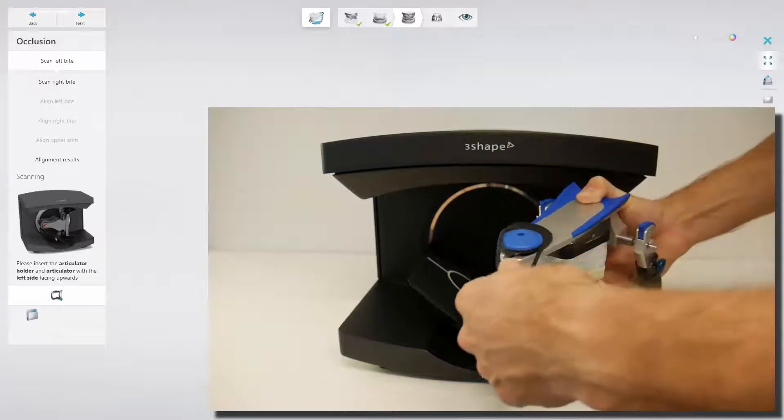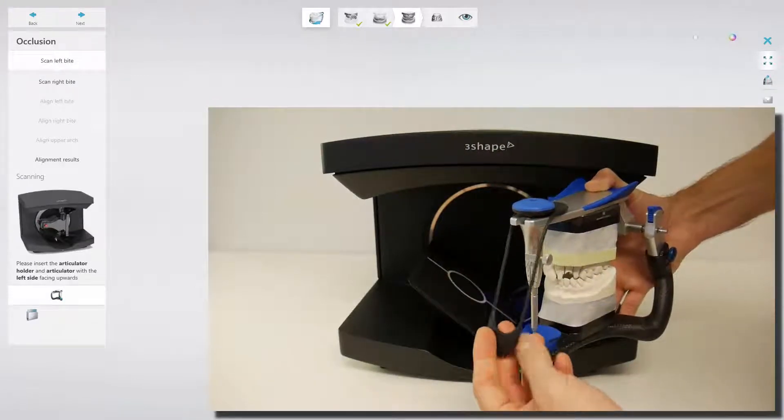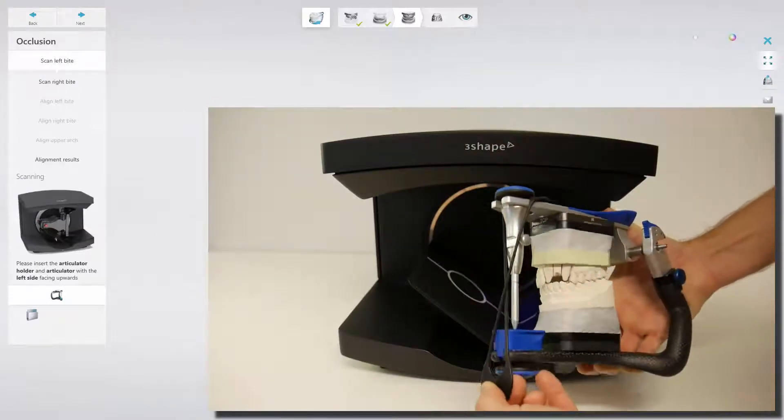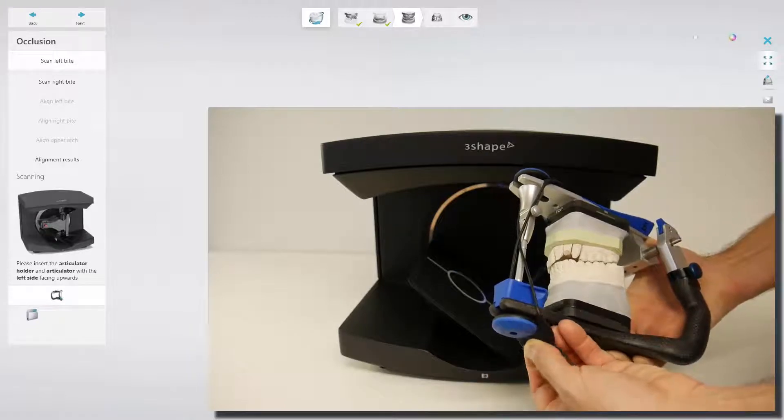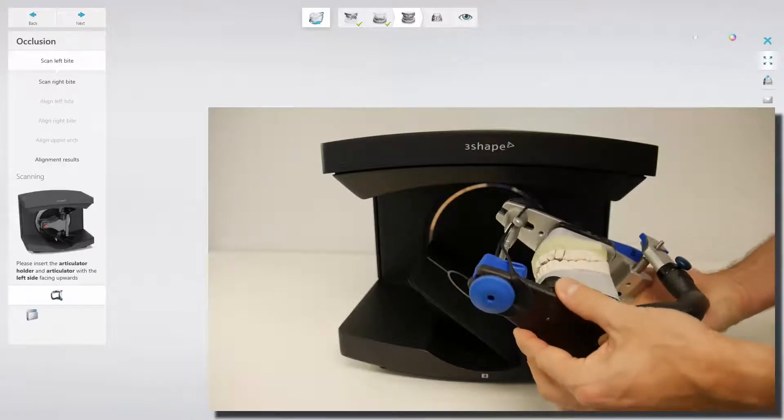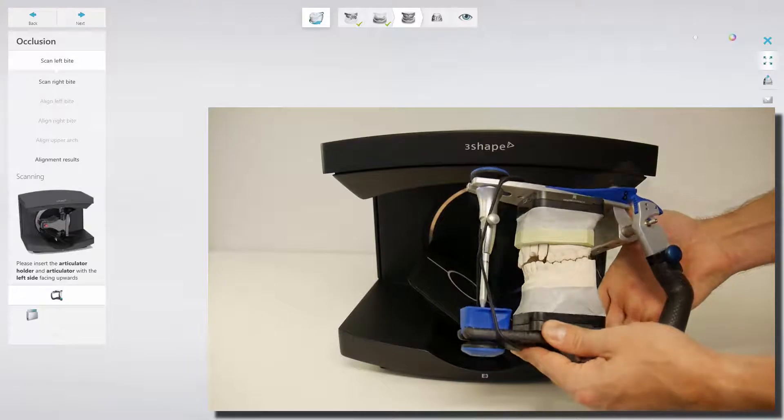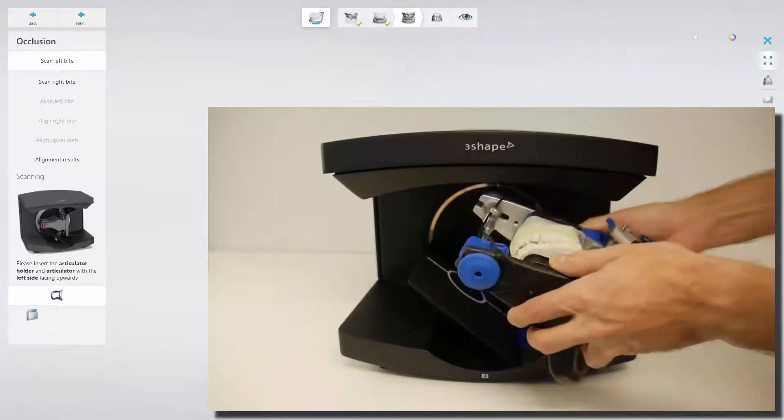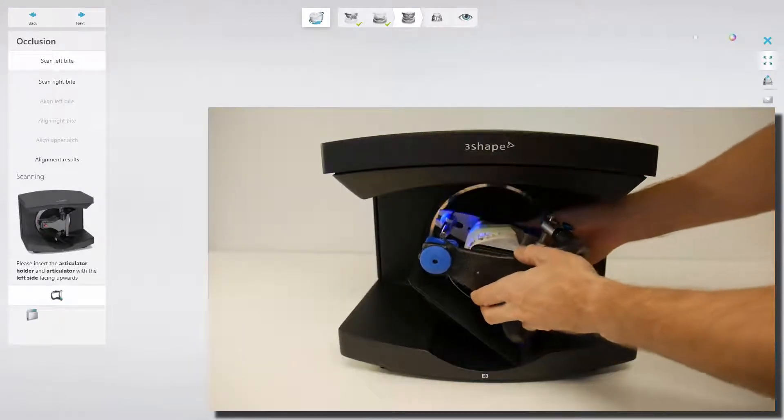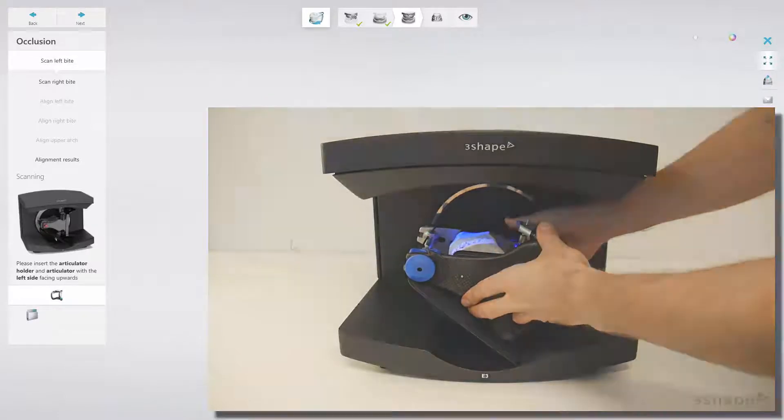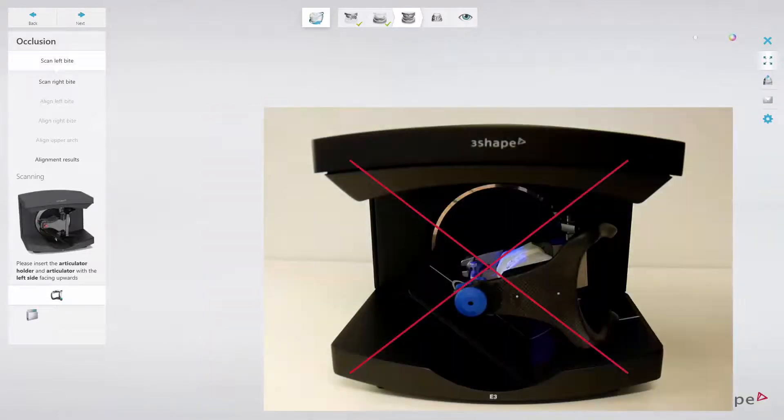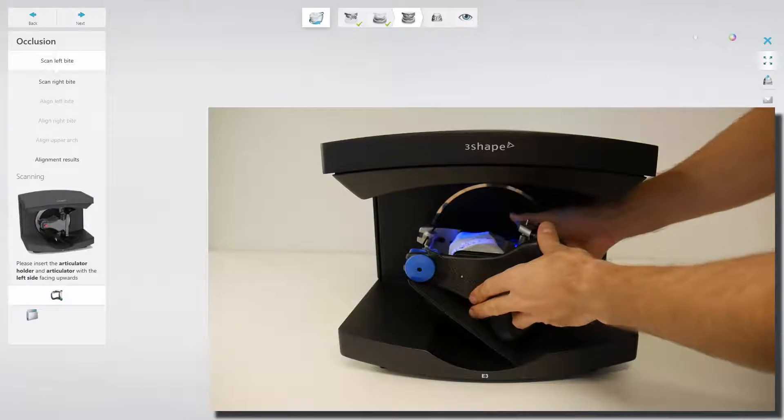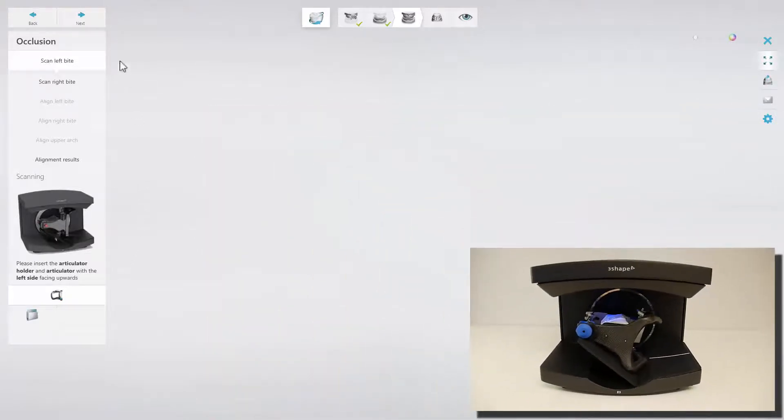When it is done, place the provided band on the Articulator with the mounted models to prevent the Articulator from opening. Please make sure that you position the Articulator in the center of the circle. To proceed, click the Next button.